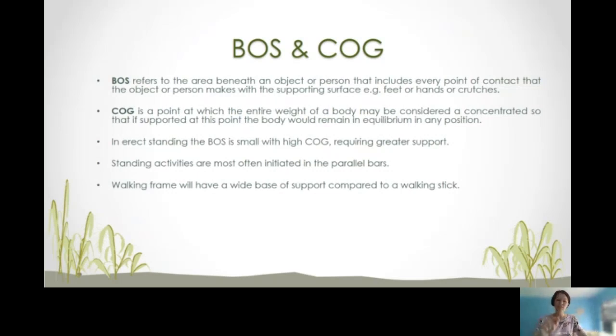But consider how the base of support increases when you add a walking frame. Now it is not only 4 points of contact with the ground, but it is 6. You see how the base of support can be enlarged to give confidence, balance, and safety for somebody that requires that.